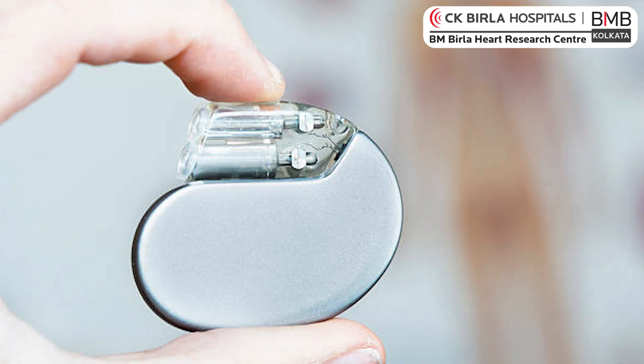A pacemaker has basically two components to function. One is called its lead and another is called its battery. The leads are required to pace different chambers of the heart or just to sense the electrical current inside the chambers.